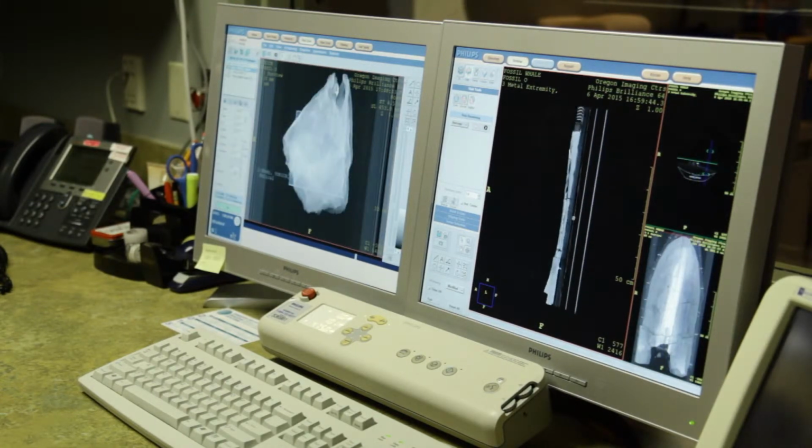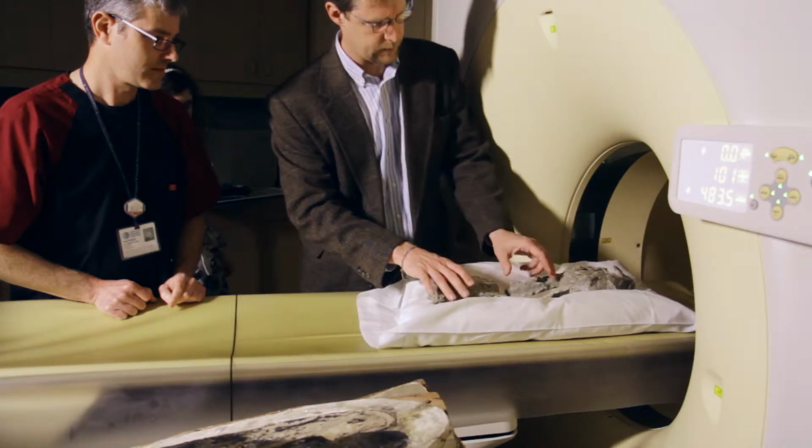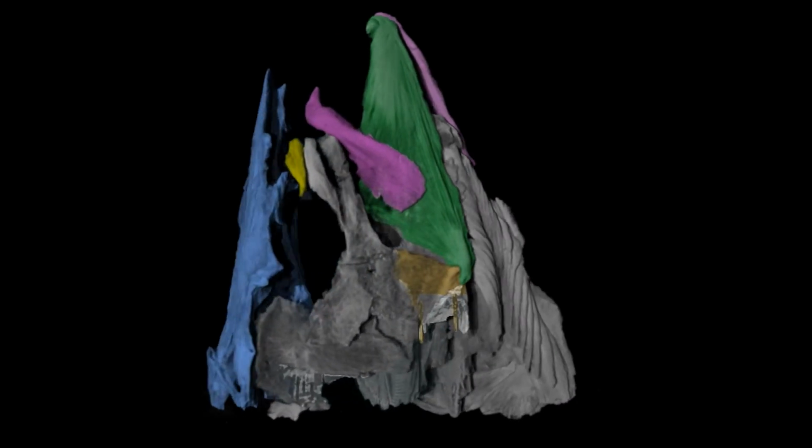In a fossil, they're all actually sort of fused together as a rock. So they're not going to come apart. We can't cook them and expect that the bones will fall apart like if we were making something that was fresh. So we can do the CT scans and digitally dissect it and actually break them apart without doing any physical harm at all to the fossil, which is great.